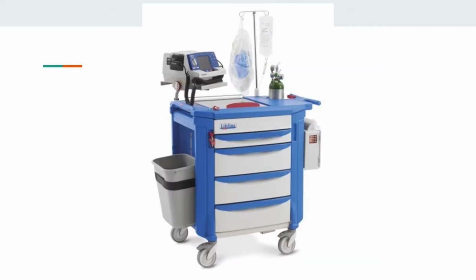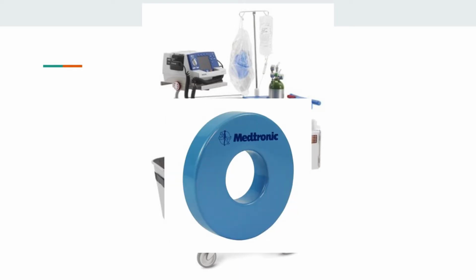These magnets are usually hanging around the code cart, by the charge nurse's desk, or in the dock box somewhere. Try looking for one the next time you're in the department.